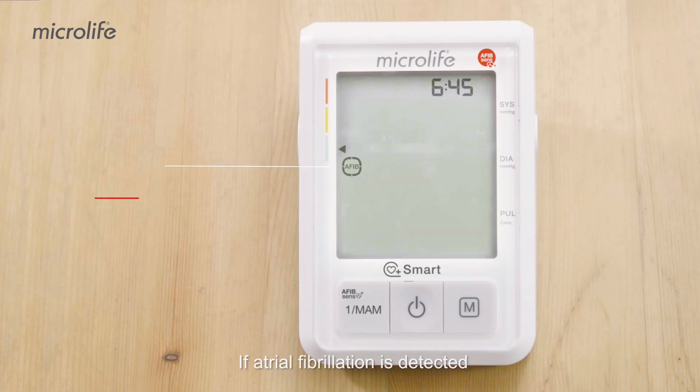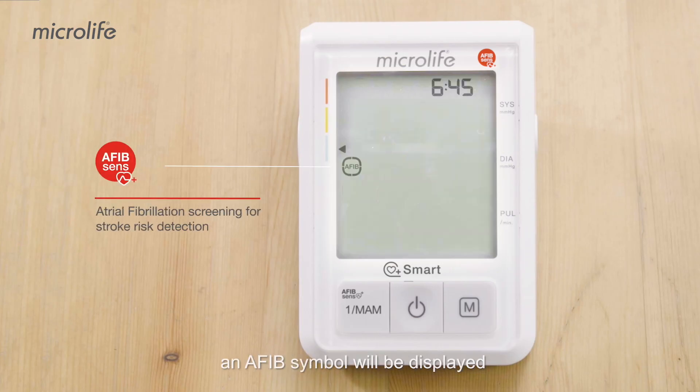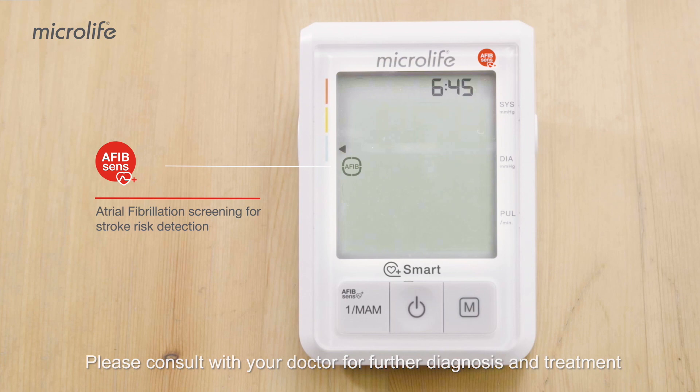If atrial fibrillation is detected, an AFib symbol will be displayed. Please consult with your doctor for further diagnosis and treatment.